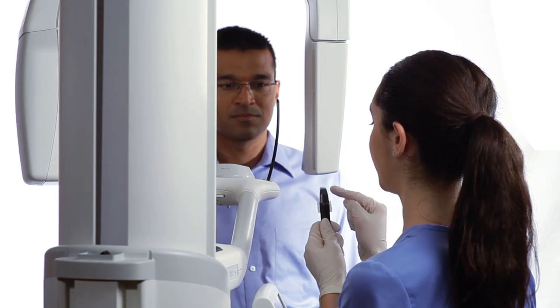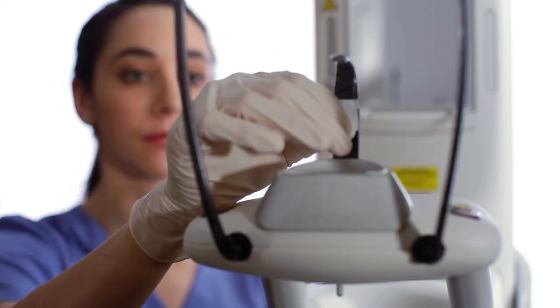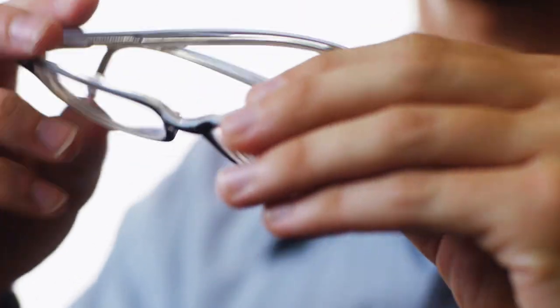Place a sanitary barrier on the bite piece. Explain to the patient that the anterior teeth will be placed within the grooves of the bite piece. Ask the patient to remove glasses and jewelry.